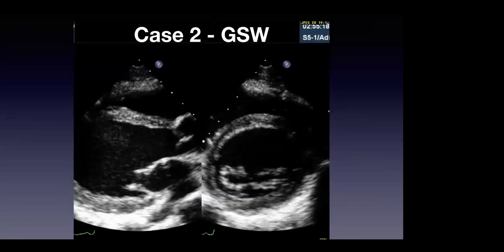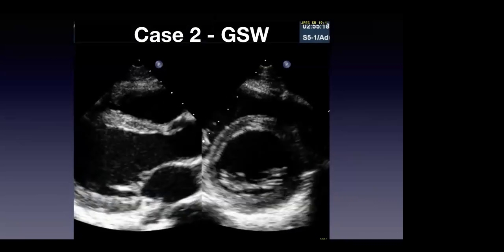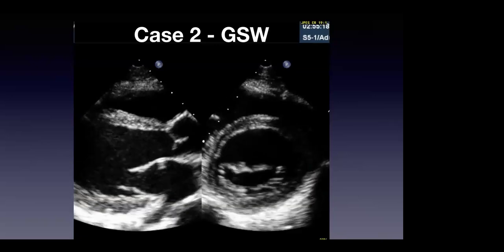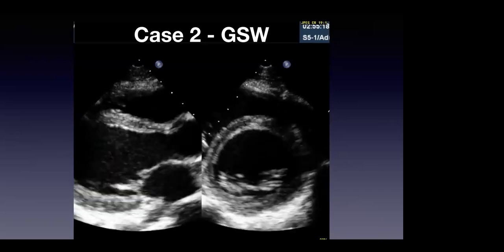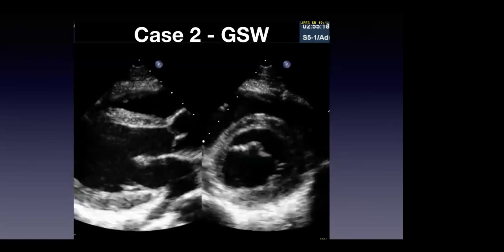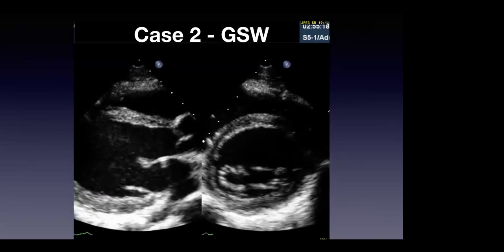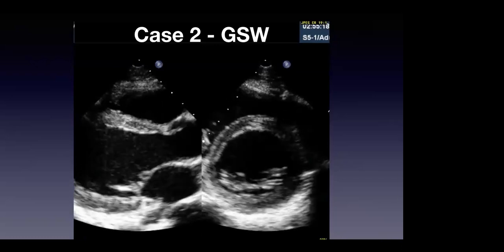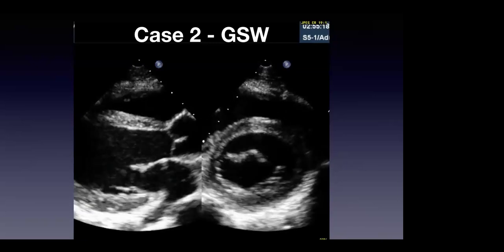So this is the transthoracic echo. You want to take a crack at this, Michelle? Yeah, sure. So parasternal long axis, then we have the short axis. Follow nicely. Well, hard to comment on EF here. It might be slightly down. Yeah, maybe low normal. He's a young guy. It's not unusual to see low normal EFs in healthy young individuals. RV looks okay. And on the short axis again, it's okay. There are no effusions. Yeah, no pericardial effusion, similar to what Chris was saying.